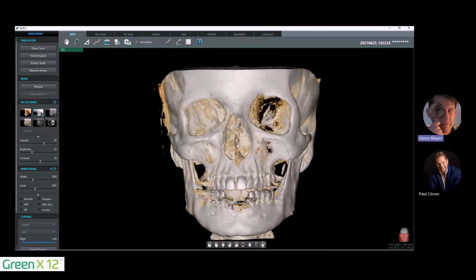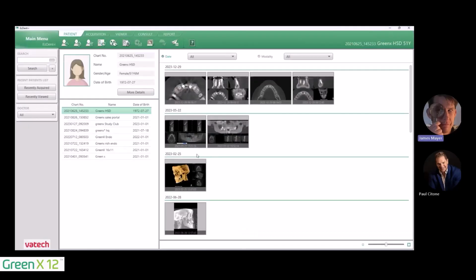And I think that about sums up what we wanted to talk about. We touched on looking at scatter. We talked about evaluating patient movement. And then we also talked about if we see any distortion in the images with that, redoing that beam alignment on the device. So I think that kind of concludes what we wanted to review on CBCT image evaluation.